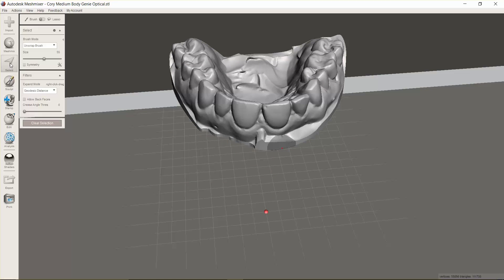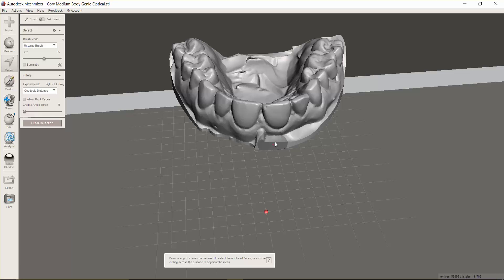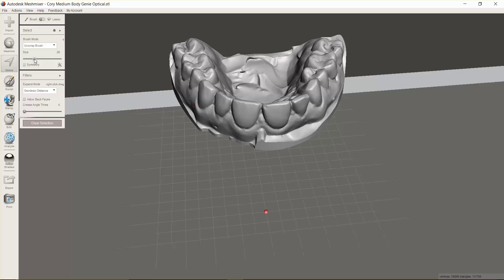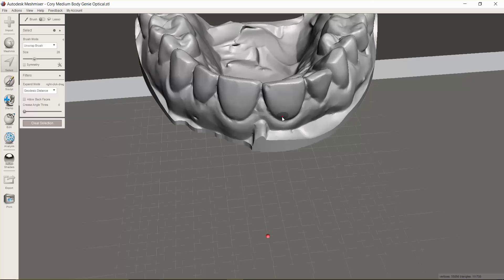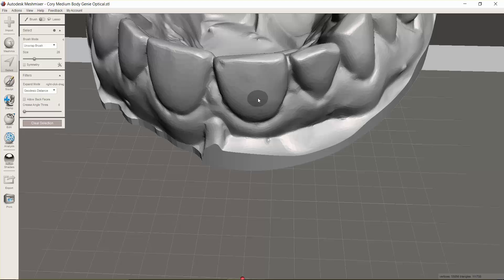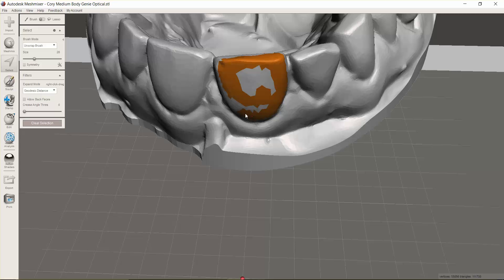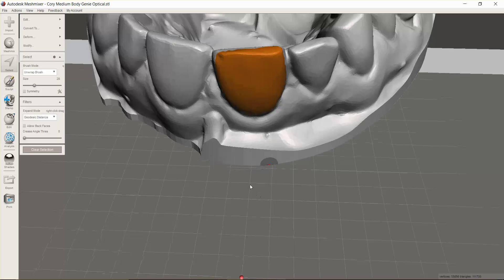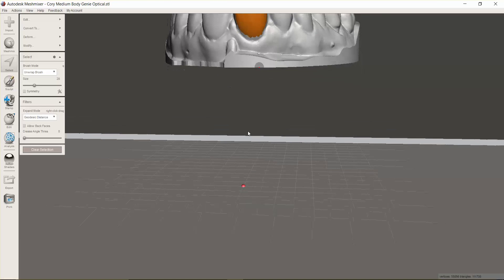The first thing we're going to do is go to Select, and we want to make the target size be a little bit smaller. We can use the scroll wheel on the mouse to zoom in a little closer, and we can just start highlighting and outline the whole tooth that we would like to basically virtually extract.